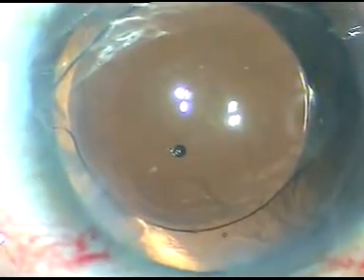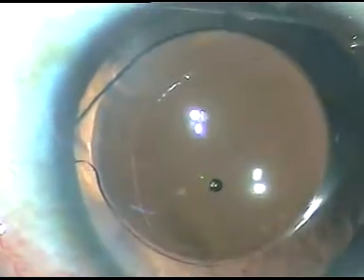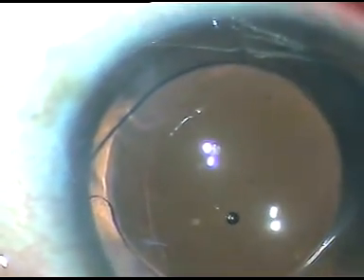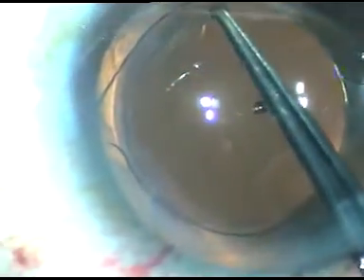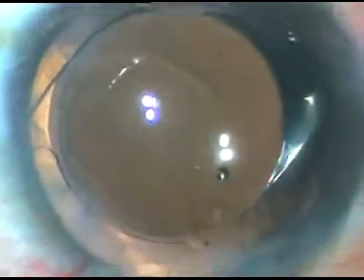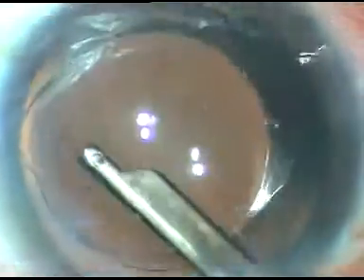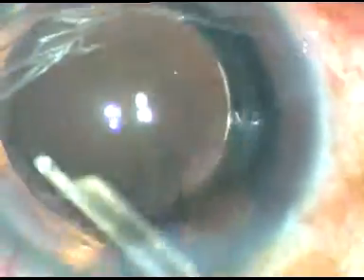Now I want to enlarge the rhexis. I'm giving a small nick here at around 2 o'clock using the utrata again. Here it is. With the utrata, I hold this capsular tag and enlarge the rhexis like this. The idea is to reduce chances of capsular phimosis. If I make a large or adequate sized rhexis, chance of capsular phimosis will be less. So I enlarged the rhexis to adequate size.